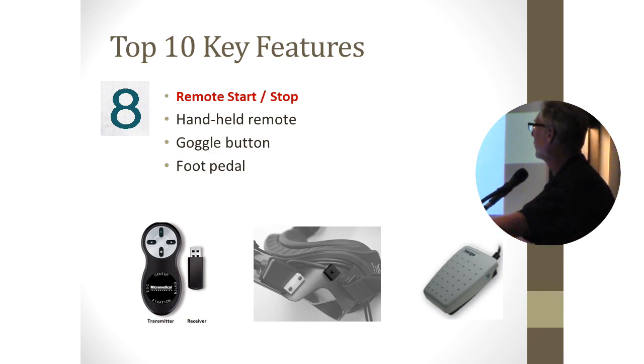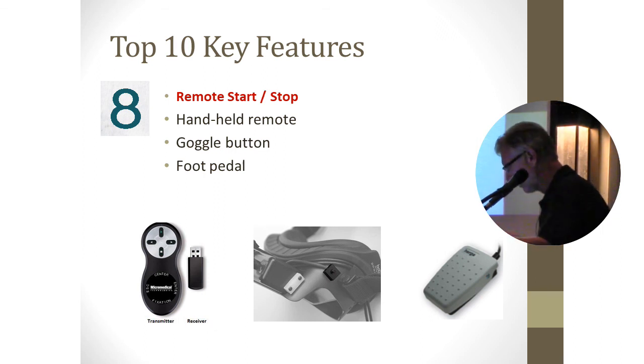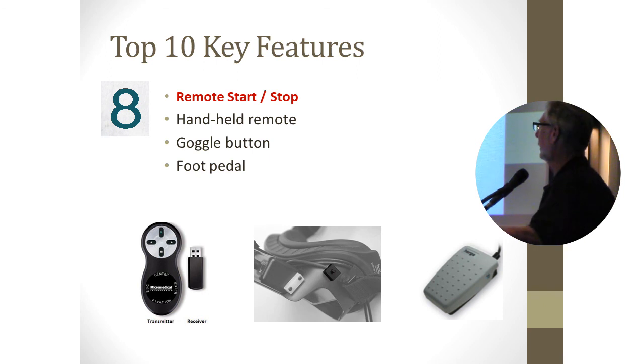There's a remote, so you can start it by a remote, but you have that hanging on a lanyard around your neck, and you can't get at it. Both of your hands are on the patient. Oh, you could have a foot pedal, and this system comes with the remote and the foot pedal for people who like foot pedals. I always lost the foot pedal. Where is it? I need it now, and it's underneath the table or something.